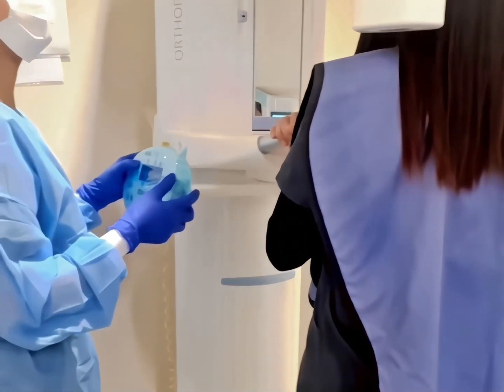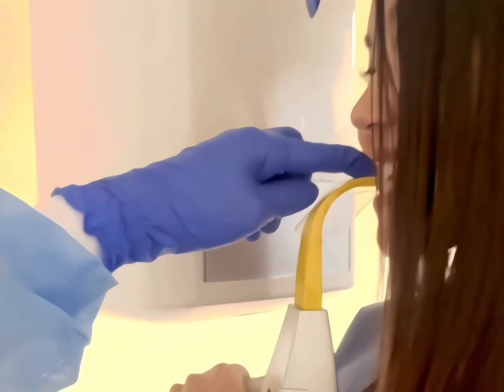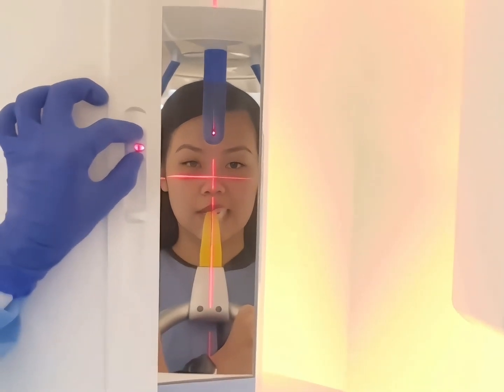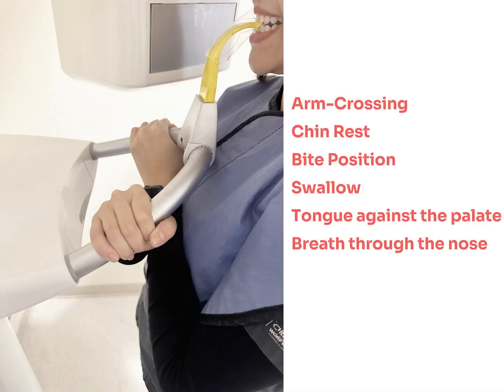This will help us properly adjust the height of the yellow bite block. Make sure it is just below the lower lip. Then have the patient tip the head down slightly to bite. This should line up the Frankfort plane parallel to the floor with minimal adjustment needed after that. The patient will then bite edge to edge within the groove and close the lips around the bite block to prevent a dark radiolucent shadow that obscures the anterior teeth.